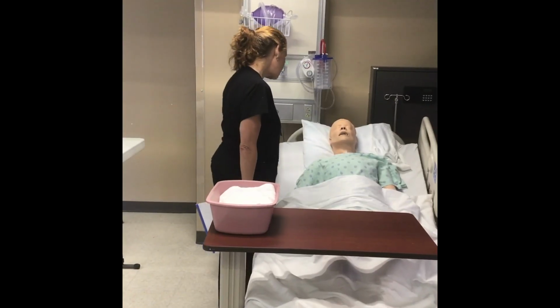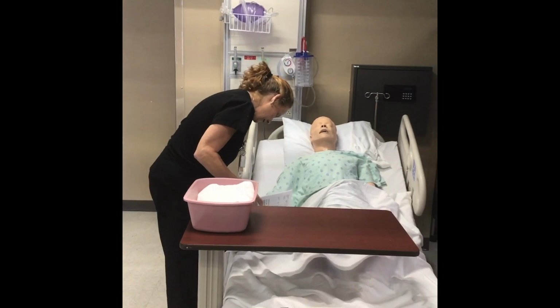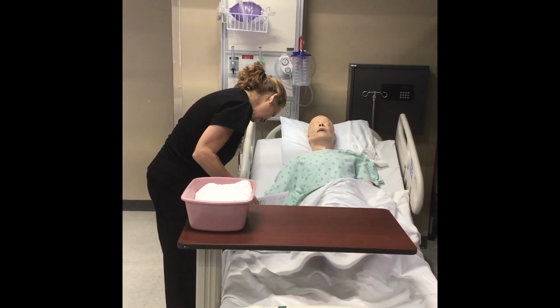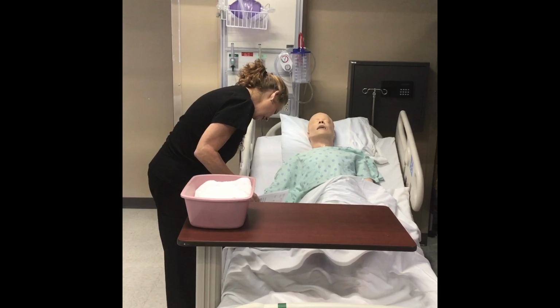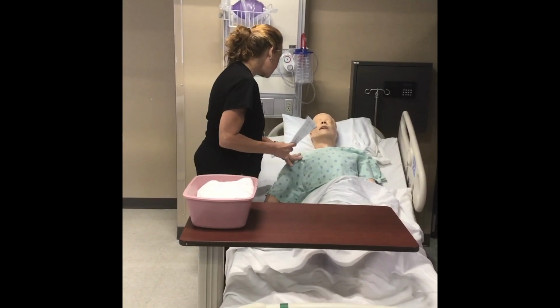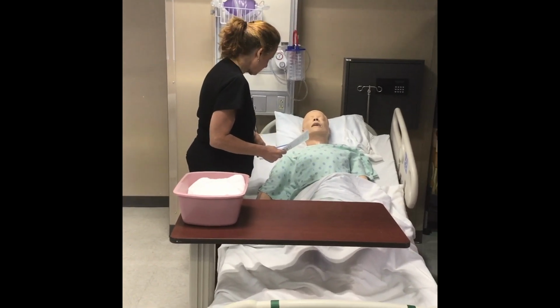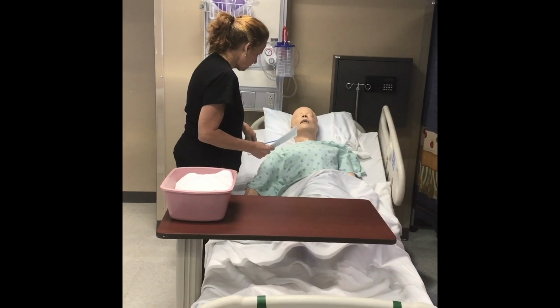Panthers, and I'm going to be your student nurse today. Can I get your name and date of birth, please? Yes, my name is Shirley Gibbons, and my date of birth is May 5th, 1964. Perfect. It's so nice to meet you. Do you have any drug allergies that I need to know about, please? Yes, I'm allergic to codeine and sulfa, and also I'm allergic to latex.